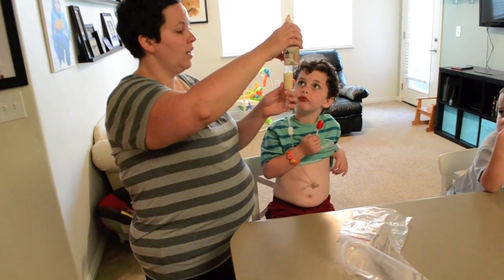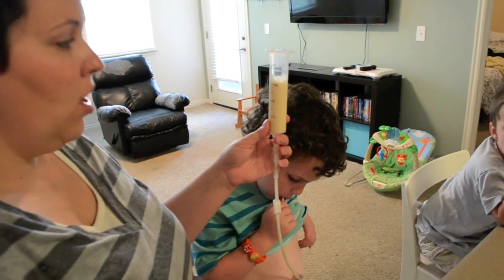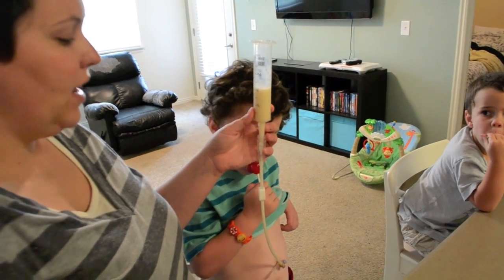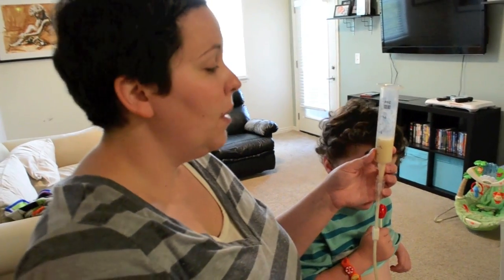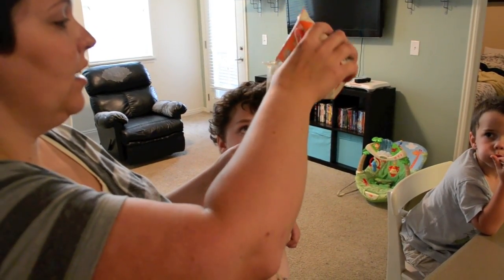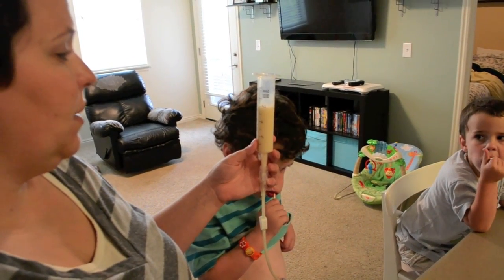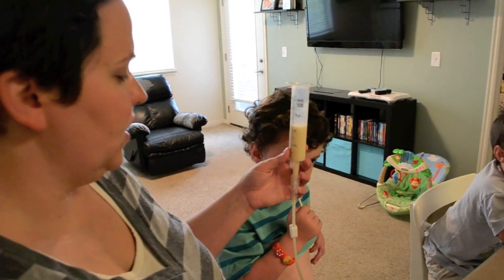Then you just pour it in. I choose not to fill it all the way up in case there's a bubble or something happens. It's called a bolus because it's a gravity feed, so you just let gravity do the work and it'll flow at its own speed. Sometimes it takes a second to start as the pressure equalizes between the stomach and the tube; sometimes it starts right away. You gradually keep adding and letting it go down until the box is empty — there are 8 ounces, so it'll typically take 3 to 5 pours.